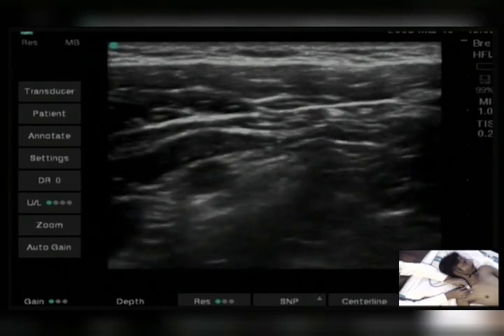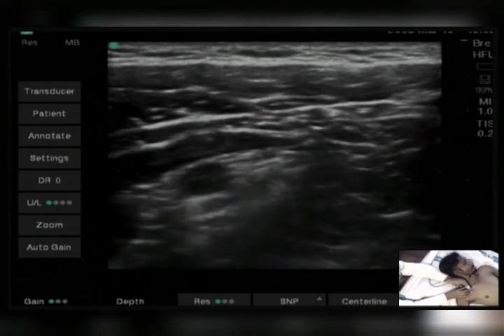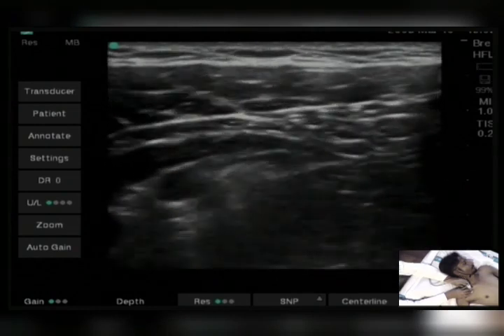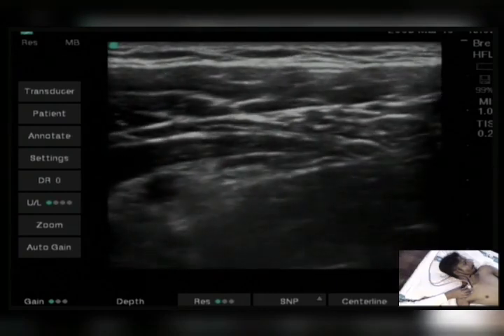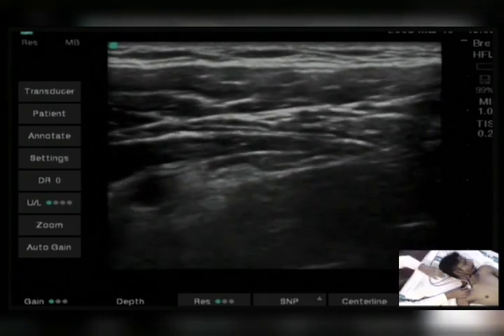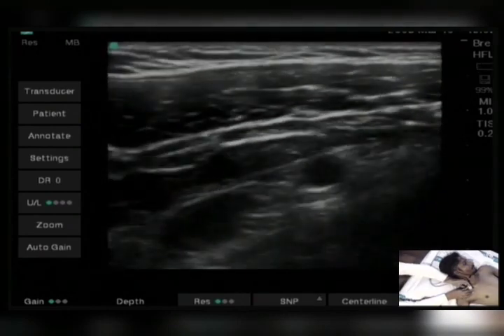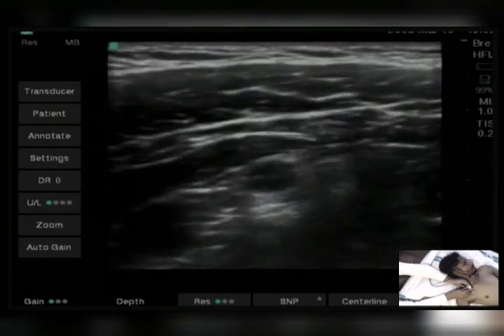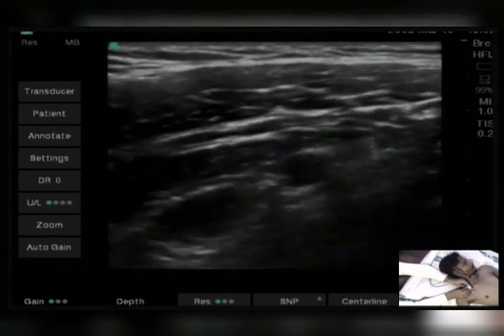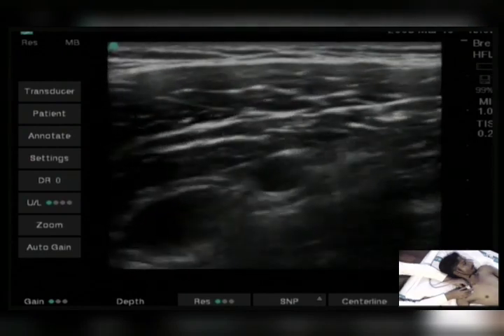Many times it is not visualized very well, and when you inject the drug, at that time you will come to know that this might be a posterior cord, or it may be present at the 3 or 5 o'clock position in relation to the axillary artery. See here, the cephalic vein entering toward the... I'm not getting that properly.